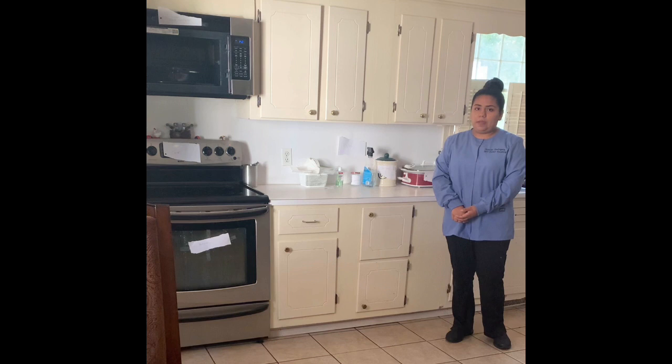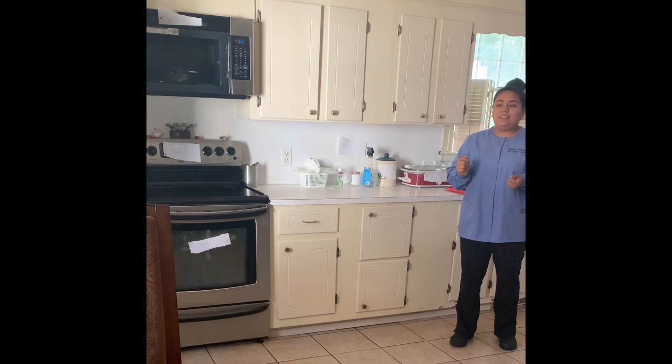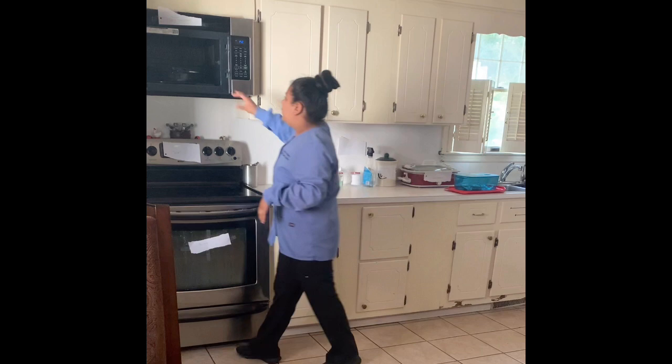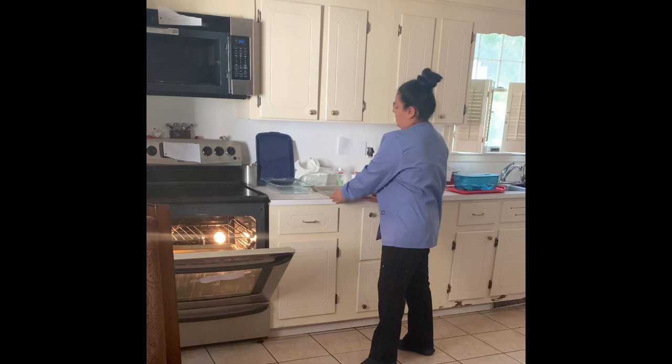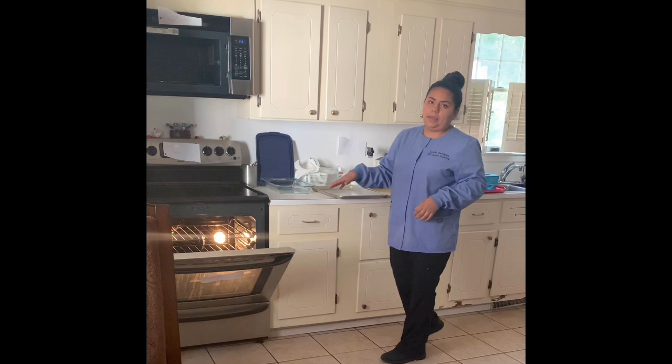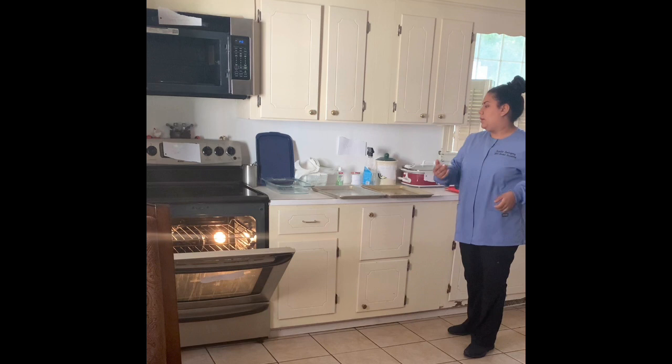Today we'll be preparing and processing the instrument tray. The first thing I have to do is put on my safety glasses and my mask. I wouldn't put on my utility gloves right now because the first thing I'll have to do is grab all my stuff. Then I can finally put on my utility gloves.